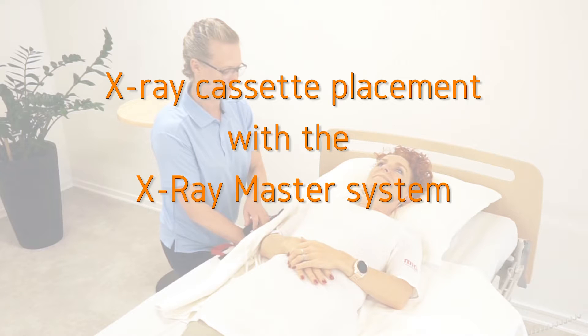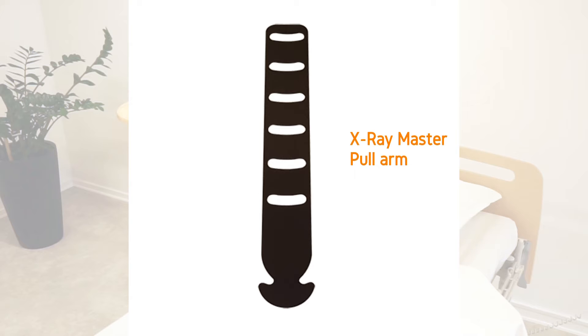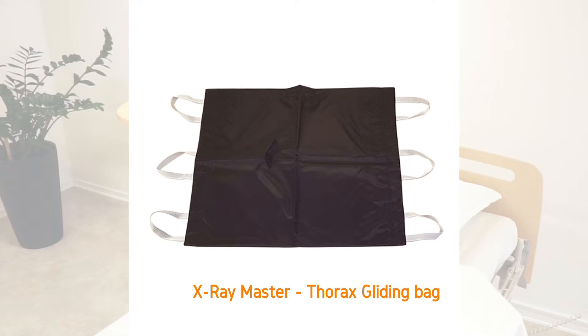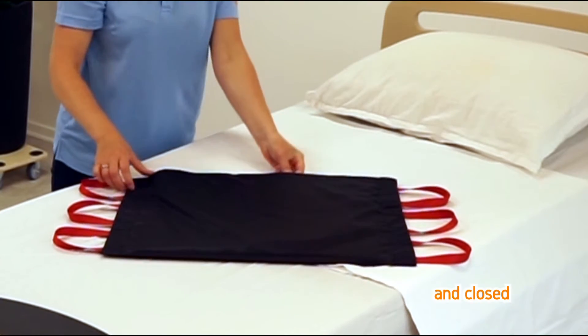X-ray cassette placement with the X-ray Master System. The system consists of a pull arm, two sliding arms, and a gliding bag. The X-ray cassette is inserted into the gliding bag and closed.